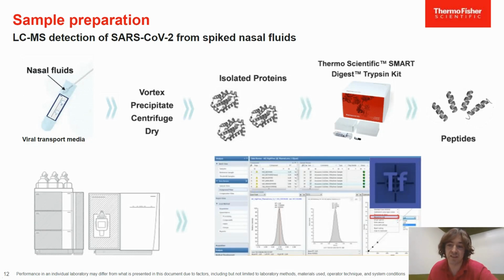In this study, a second analogous workflow was also run in which the recombinant target proteins were spiked into saliva that was then incubated in viral transport media. The rest of the workflow was then identical and was done to demonstrate the feasibility of using our method to quantify proteins from a second viable collection matrix. The whole workflow was successfully implemented within around 2 hours.